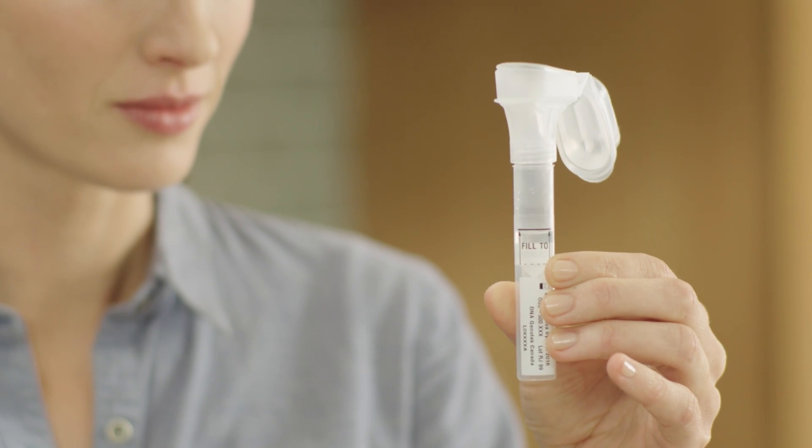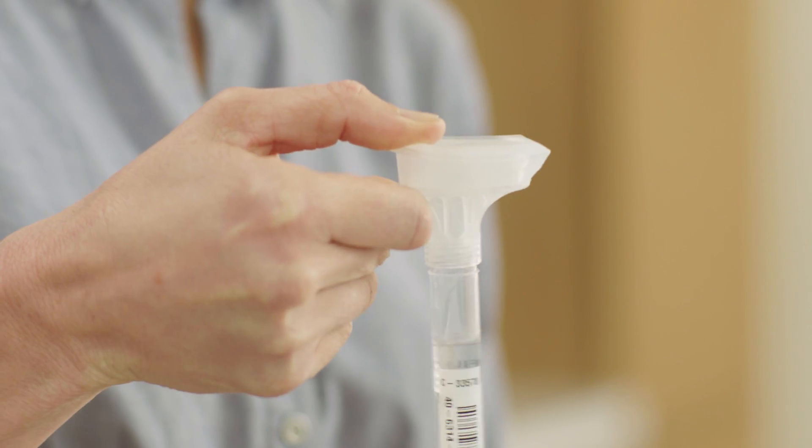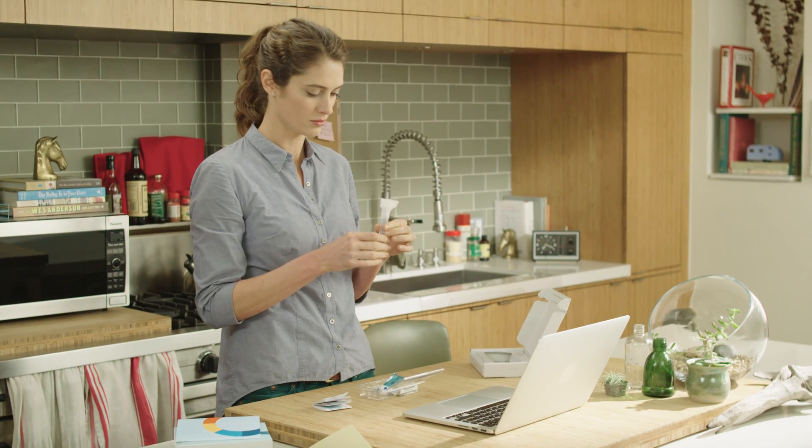Once you've reached the fill-to line, hold the tube upright with one hand and close the funnel lid with the other hand by firmly pushing until you hear a loud click. Don't be surprised when the fluid from the lid is released into the tube. Make sure it is closed tightly.